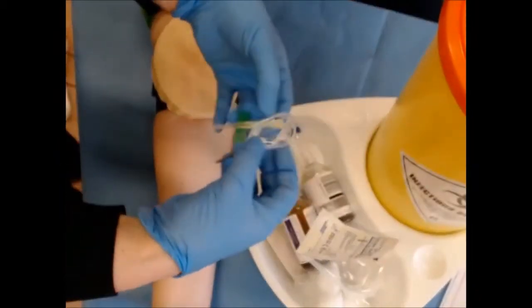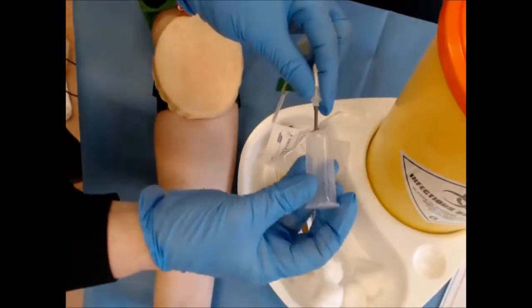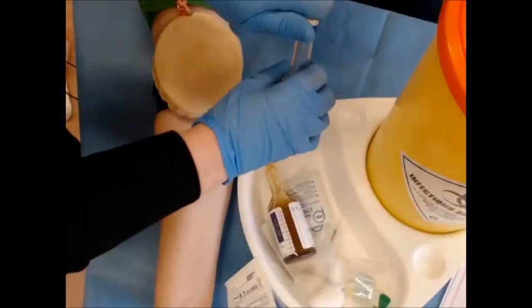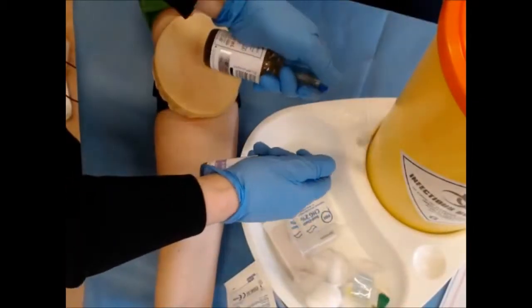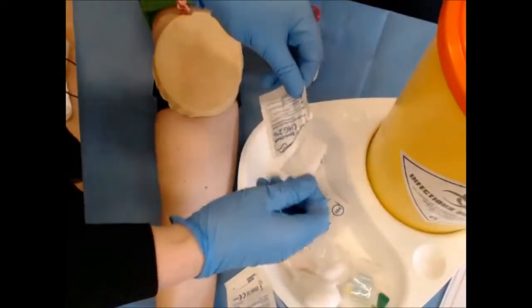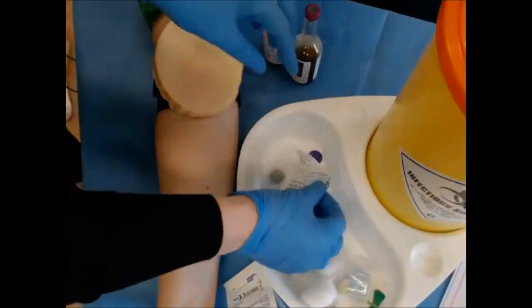So here we have the butterfly needle and the vacutainer. So open both your blood bottle samples. Take one of your chlorhexidine wipes, clean the top of it. One, two, allow 30 seconds to dry.